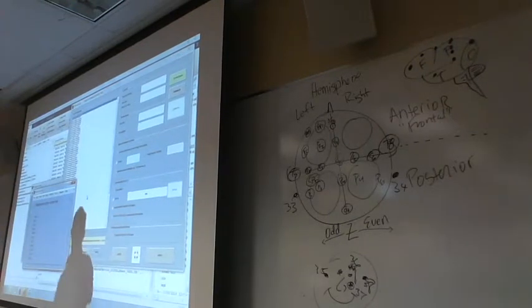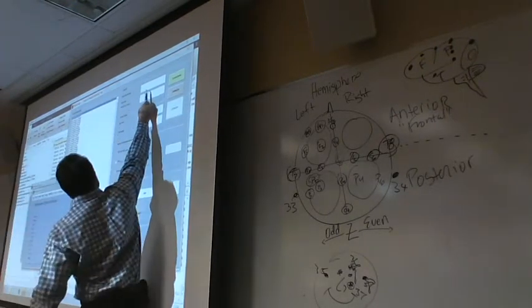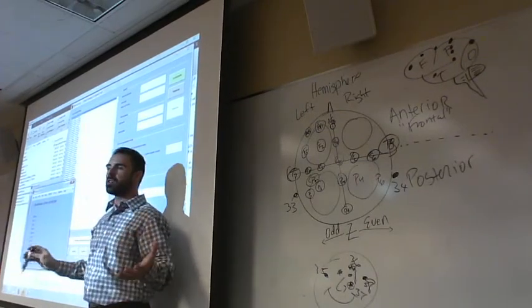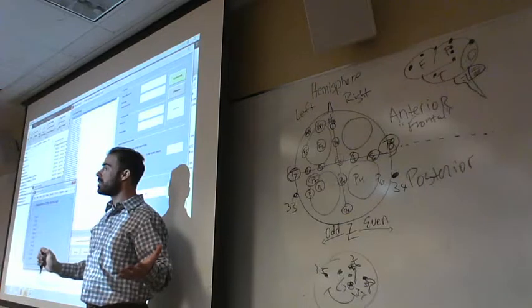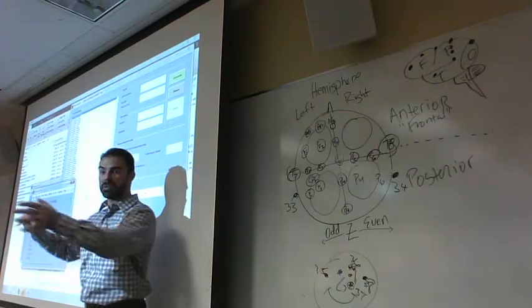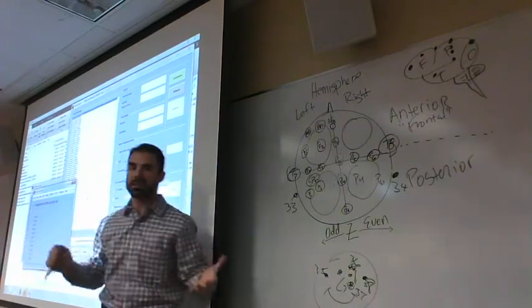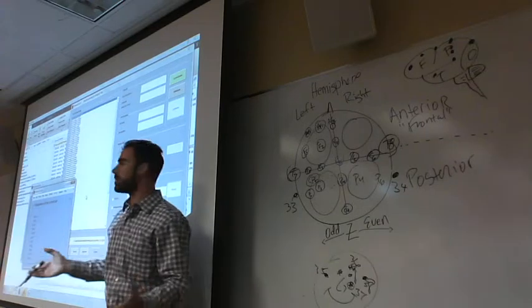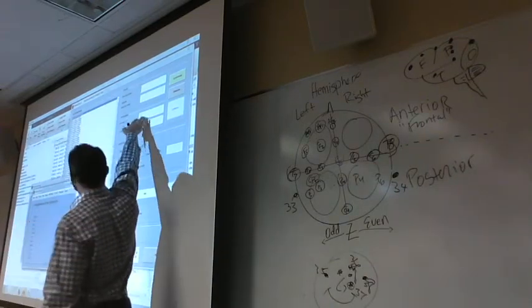So then what it's going to ask, so we give it this, and we give it that. That's our event label. Then it's going to ask us to start slicing this into bins. Remember we talked about sorting socks into bins? Different color socks you put in different bins if you're doing the laundry. That's the idea with bins here with ERPs and EEG. And they're critical because that's what's going to allow us to categorize these different cognitive experiences. So we want to start creating bins.